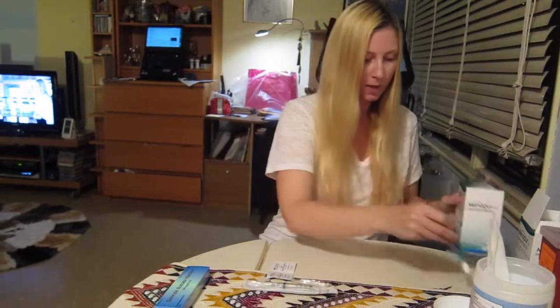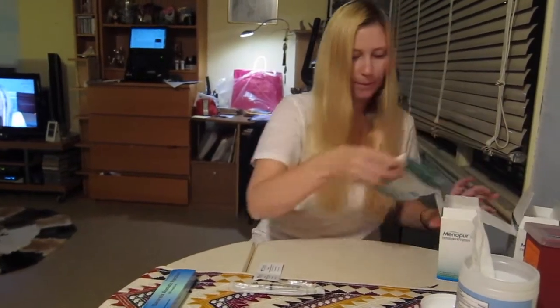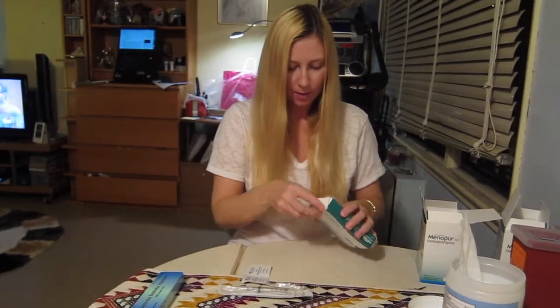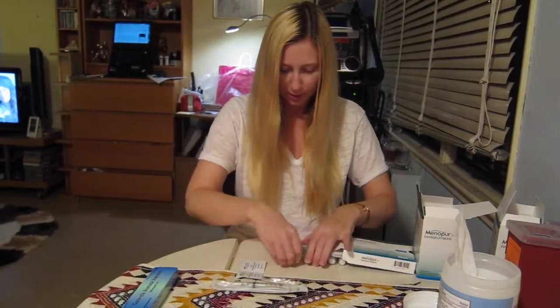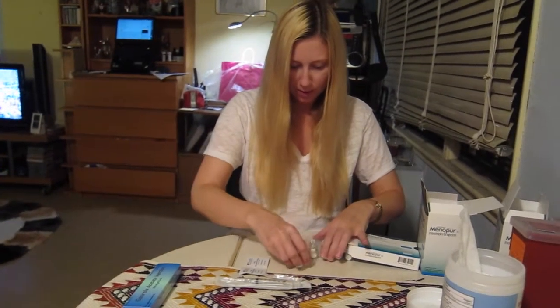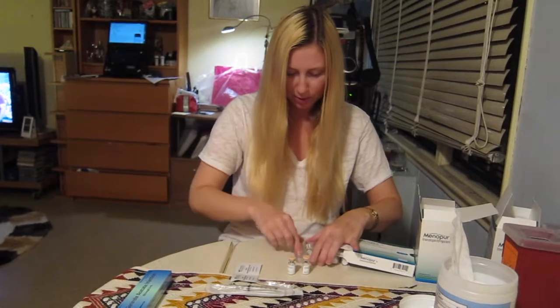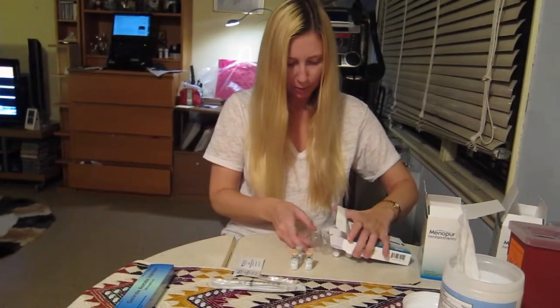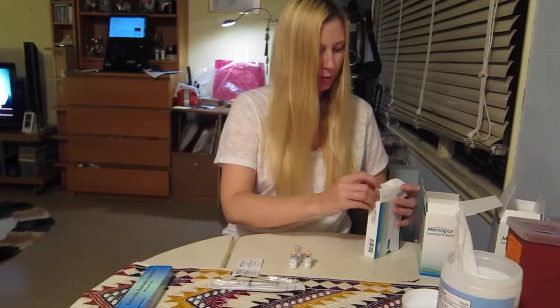Menopur is the one that I'm going to mix. I've so far been administering about 150 units of Menopur, which means I have to mix two bottles of substance with one liquid, and I'll show you how I do it.